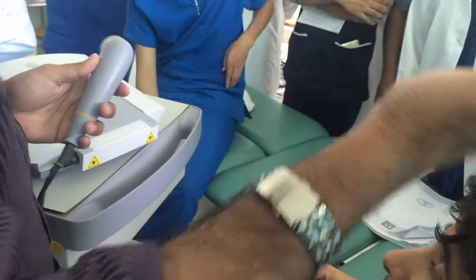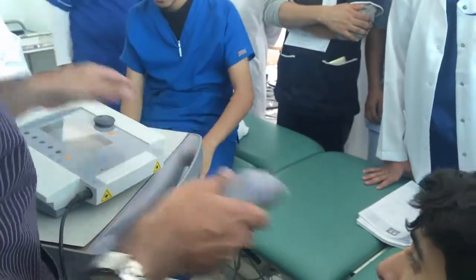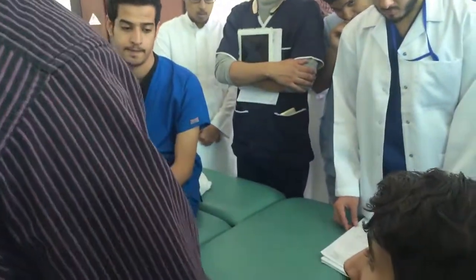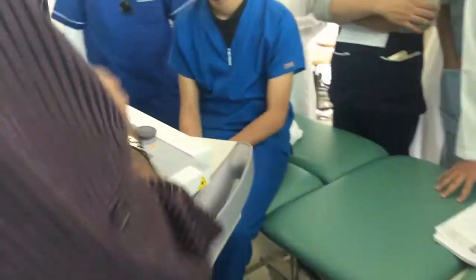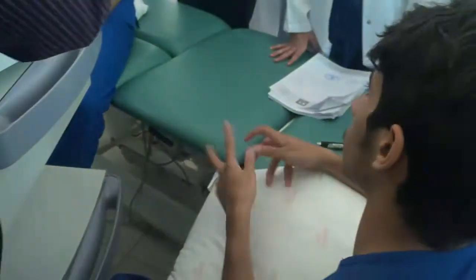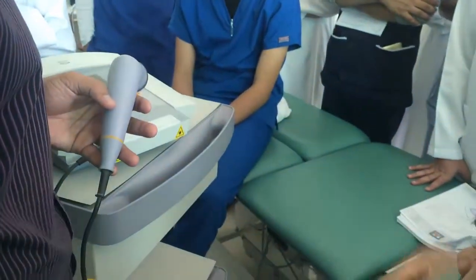Most of your students, when you come for exams, they just talk for 1 or 2 minutes and put the machine on. That is wrong. Understood? We should talk, we should ask what is the problem, rule out the contraindications. You have to arrange the pillows, all those things. You have to arrange the machine. You have to see whether it is working or not. You have to explain to the patient why I am giving. We have to give instructions and warnings. Understood? This is the problem, this is what I am going to select. We have to talk about all those things and make sure that the patient is positioned comfortably.